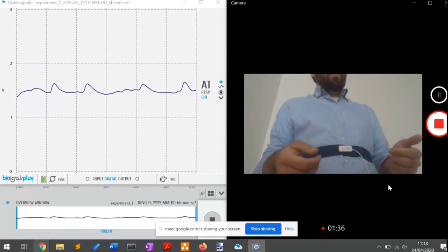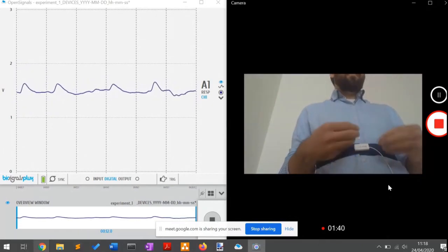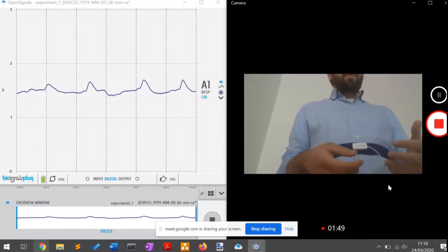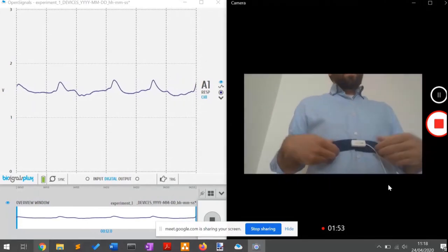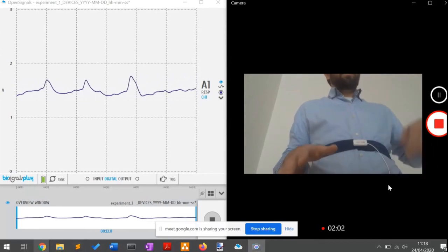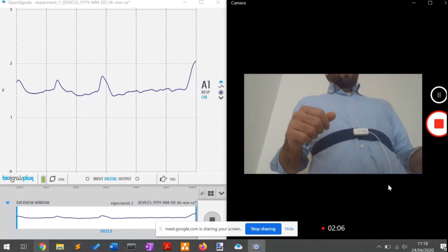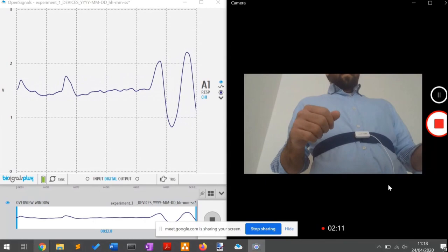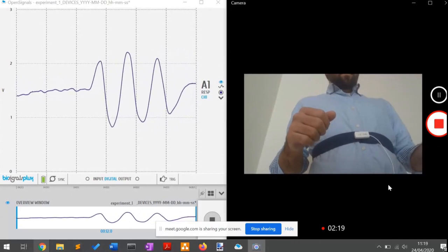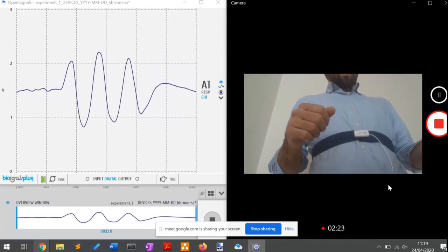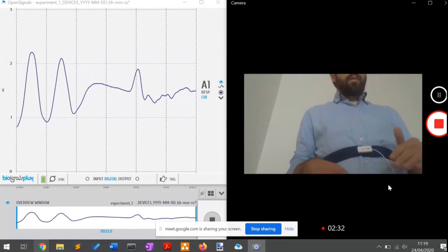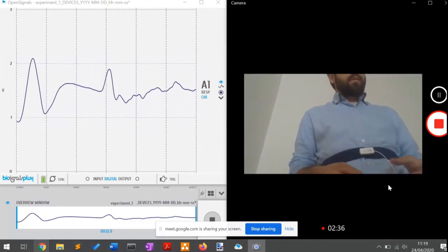I would also like to show you the issue with the sensor in terms of apnea. If we hold our breath, the sensor is a bit counterintuitive. I will do two or three cycles of deep breathing and then hold my breath. In this example, you see that the respiration cycles are clearly visible in the signal. When we hold the breath, the signal does something counterintuitive to what we might expect.